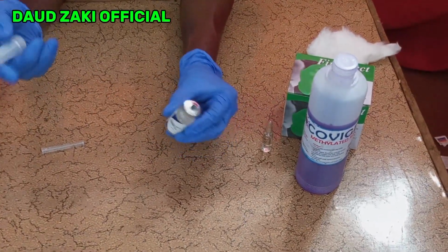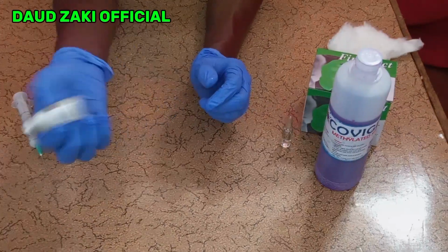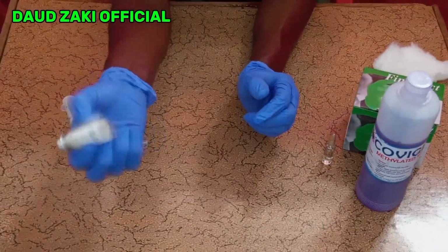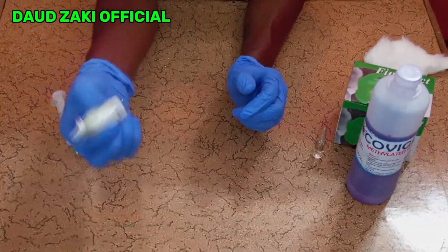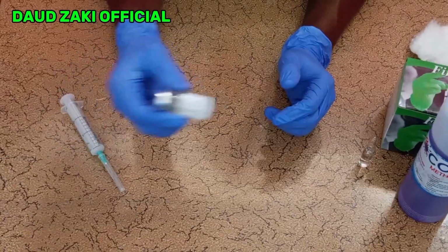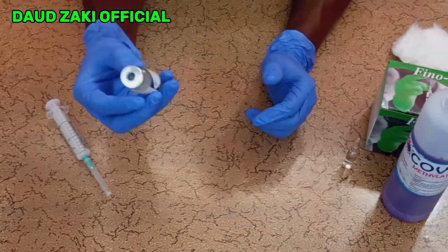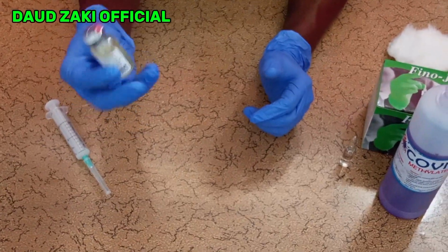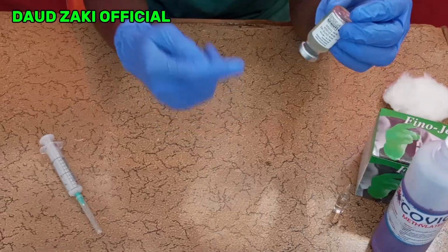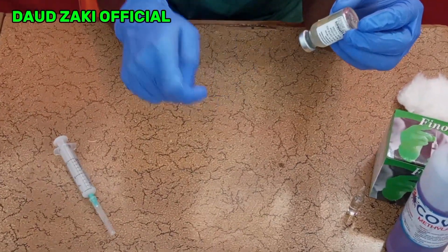Then you remove the needle. You start shaking the vial gently for the drug to dissolve completely. Shake the vial gently until the drug dissolves completely, containing no visible particles or any foreign particles. Before you start withdrawing the drug, ensure that there are no visible or foreign particles inside the vial.